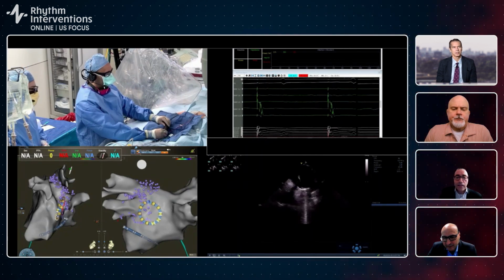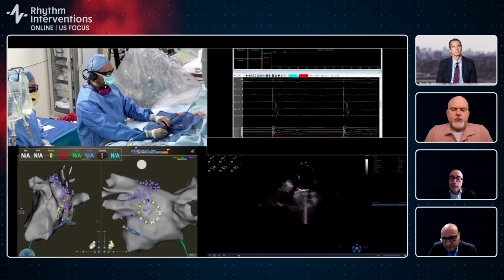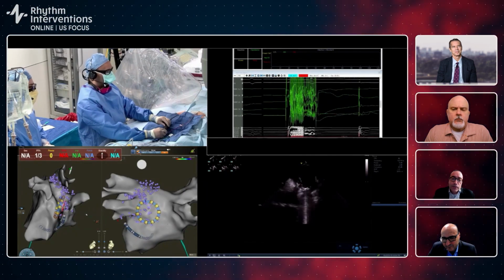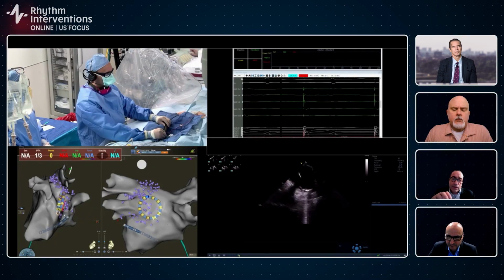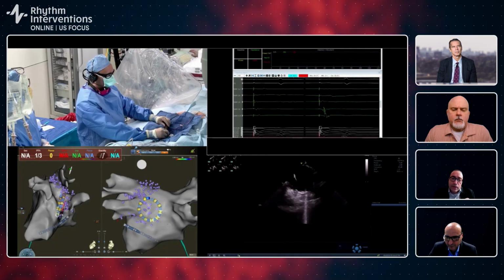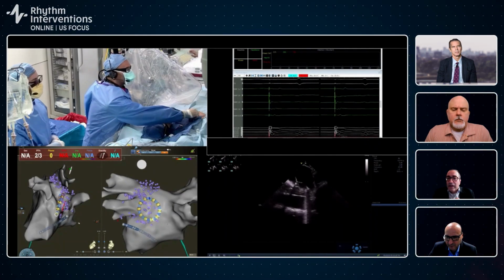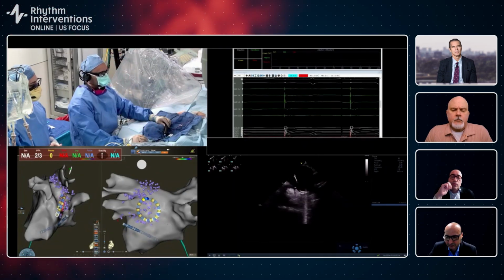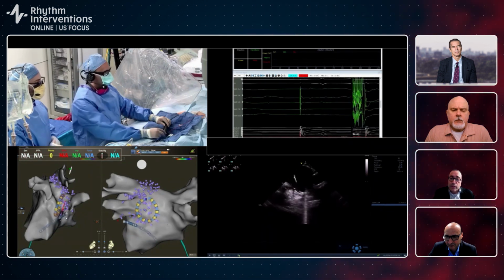Oussama, along the same lines, I was trying to. Sorry, Brad, but I think it is just along the same points you were raising, Brad. I think though with this design, what we can do, and I was in the study, is we put it into the vein, expand it, and then when it's round, do something very close to the ostium, or maybe even distal to the ostium, and then try to lay it flat on the rest of the tissue. Is that something to consider, Moussa?